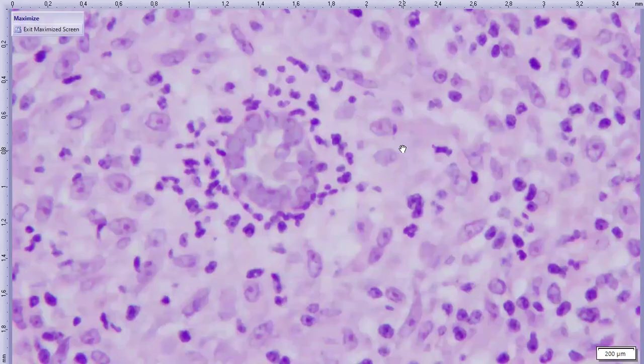In this case, I didn't recommend the panfungal PCR because it's pretty much a slam dunk for at least Coccidioides species, and knowing what specific species of Coccidioides it is probably won't affect their treatment plans or prognoses or anything like that. But yes, if you do want a particular species of fungus, that test is available.